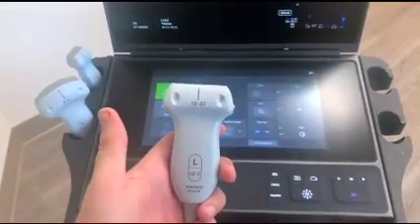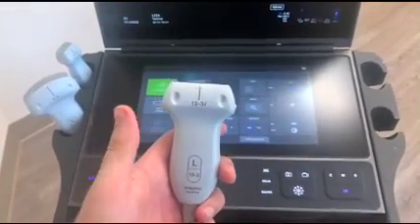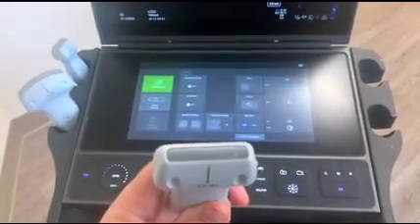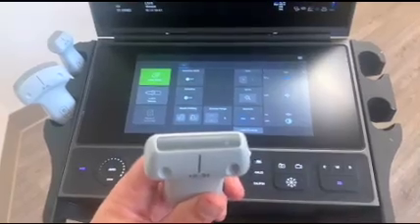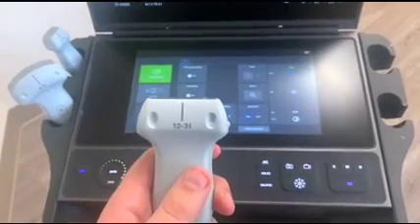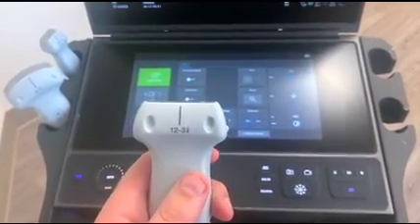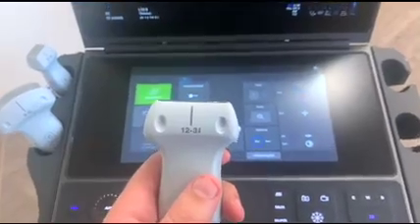This is the linear probe on this machine. It's slightly larger than you guys may be used to, but it's better for doing lines and blocks.